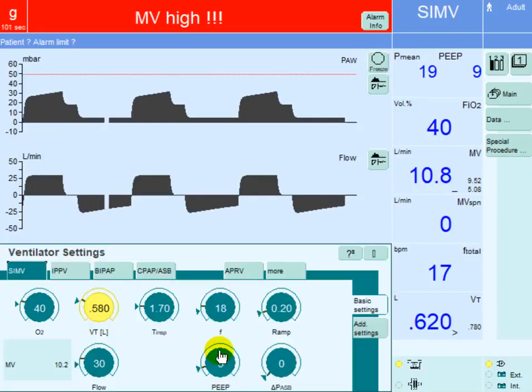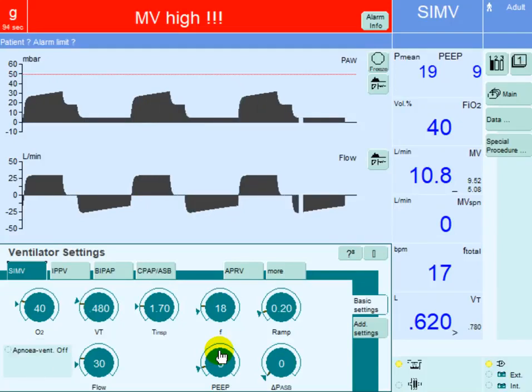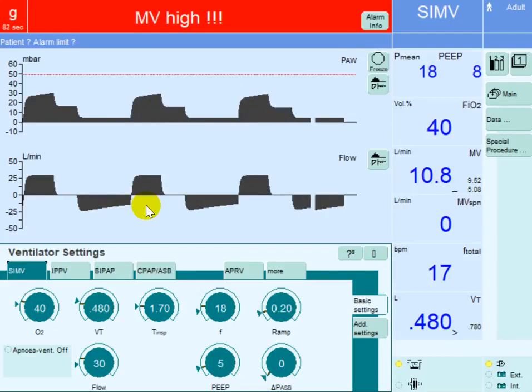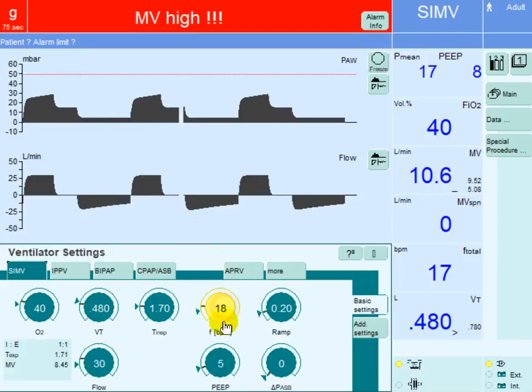So let's go down on the tidal volume to 7 ml per kg. Since his ideal body weight is 70 kg, let's give him 480 ml. You can see that the dynamic hyperinflation has improved slightly — we're putting less air into the lung, and of course that will be associated with less air trapping.